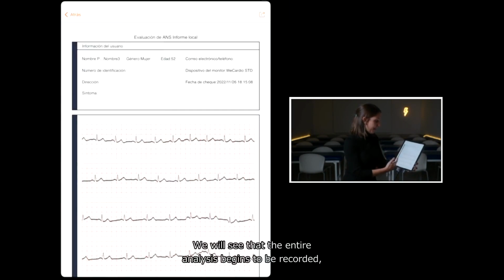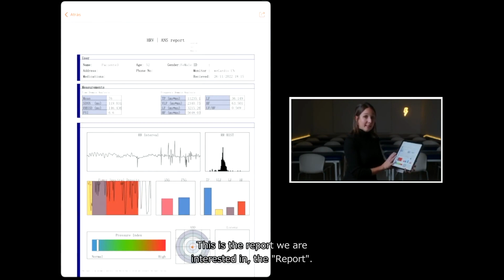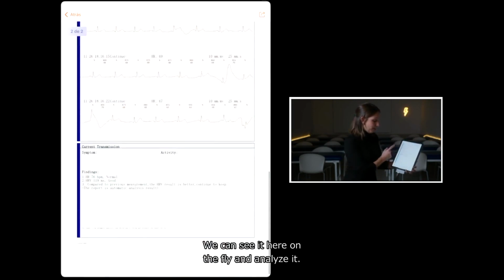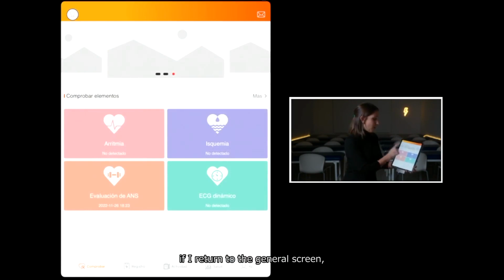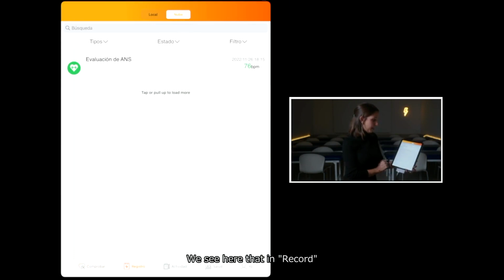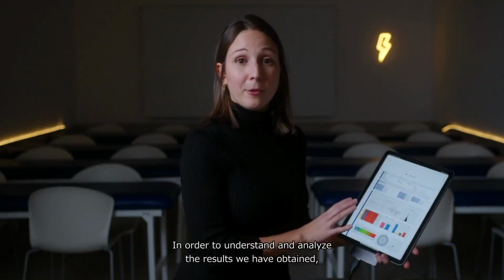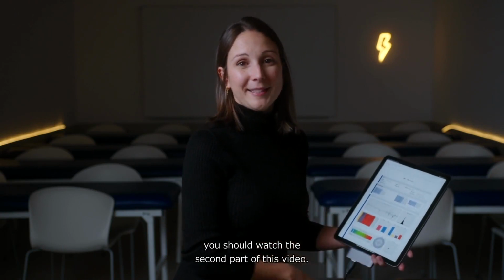We will see that the analysis begins to be recorded, both the electrocardiogram and our report. This is the report we are interested in. We can see it here on the fly and analyze it. Or if I want to visualize it at another time, if I return to the general screen, I will find it very easily in Record. We see there that in Record we have the evaluation of the autonomic nervous system, carried out today at this time. In order to understand and analyze the results we have obtained, you should watch the second part of this video. Thank you.